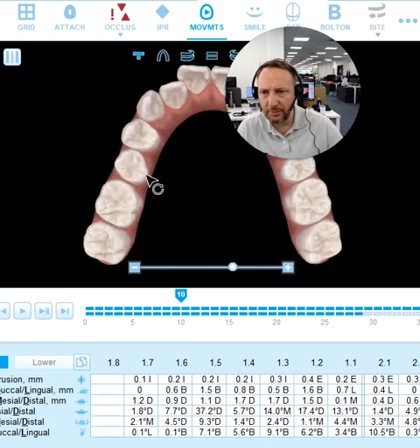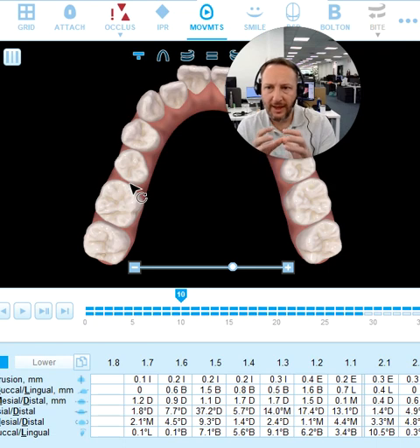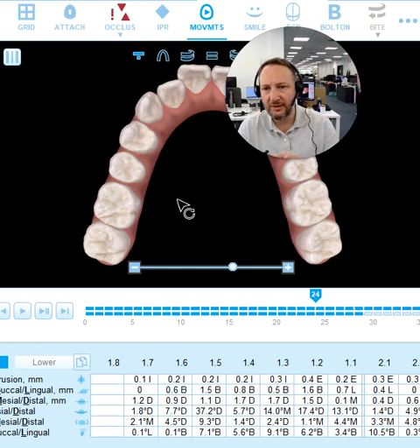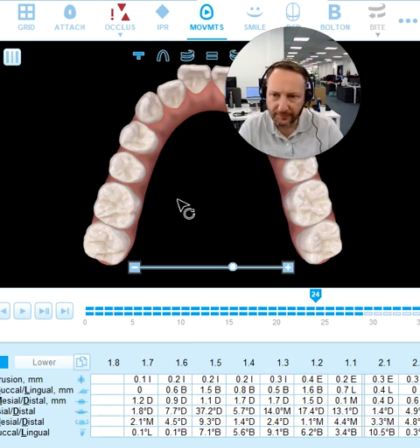When we open a space here, the plastic can hold the crown and improve the retention over it. Only at this moment do we start the movement to correct the rotation. Here we have space mesial and distal, so the plastic can hold the crown better and allow the tooth to move with more predictability.